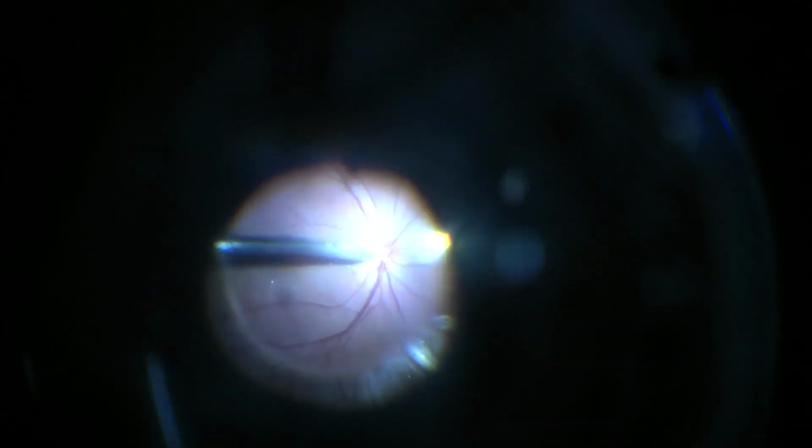PVD creation is very important in these situations. So one has to first stain this transparent vitreous so that it can be removed. The core vitrectomy is done, and once core vitrectomy is finished, one should always create a PVD, because later on this peripheral cortical vitreous, which is adherent on the retinal surface, will shrink and may cause a pucker at the macula. So in young patients, the vitreous is very much adhered and it is difficult to remove.